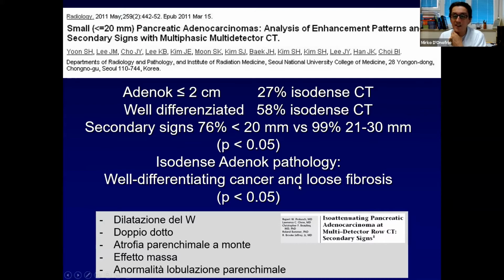So the lesion is well vascularized and isodense with respect to the pancreas, because we are using this kind of imaging method. The technique on CEUS is completely different, and so the lesion will appear hypoechoic, because we are studying with a blood pool agent only the vascular supply of the ductal adenocarcinoma.